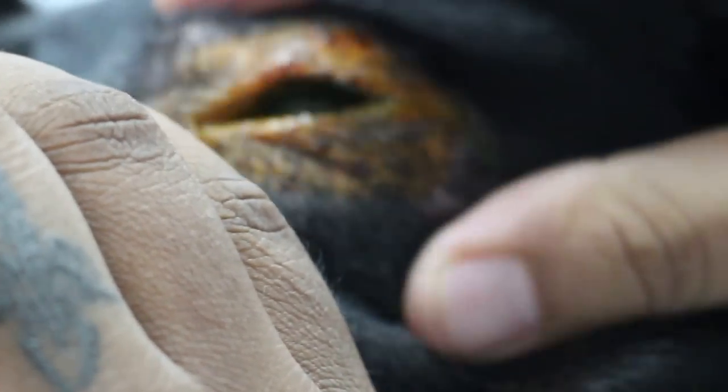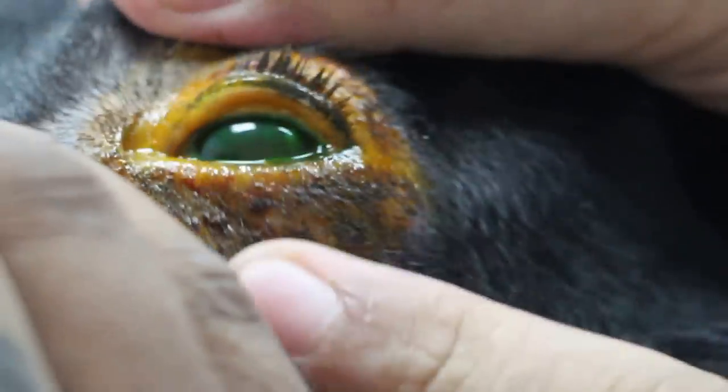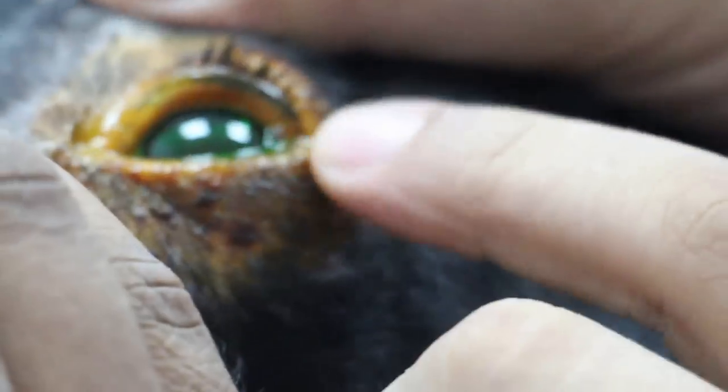After about 1 minute we will see any green colour. If there is green colour, it means there is an issue. Open up first — any green colour? Let me see. Yeah.